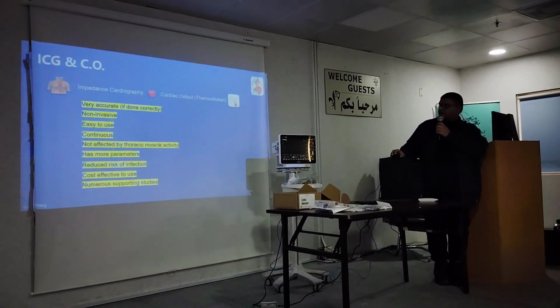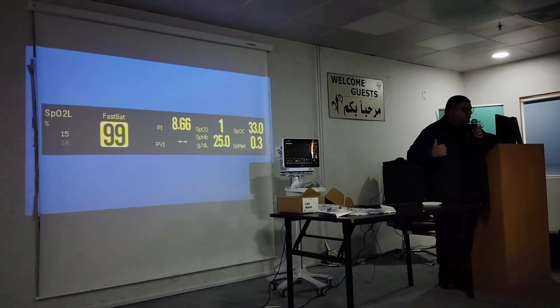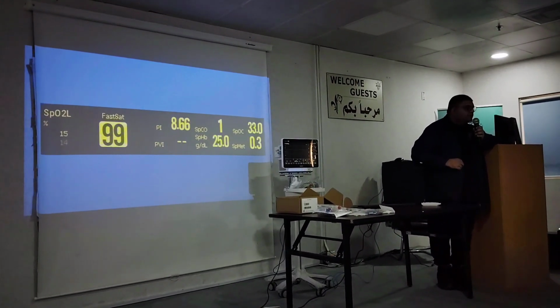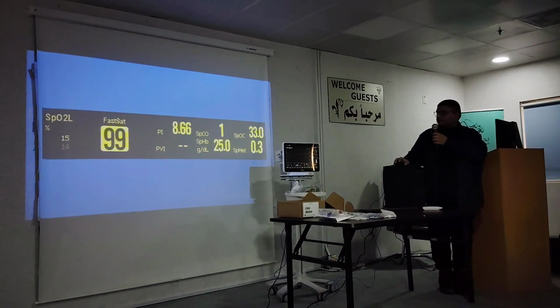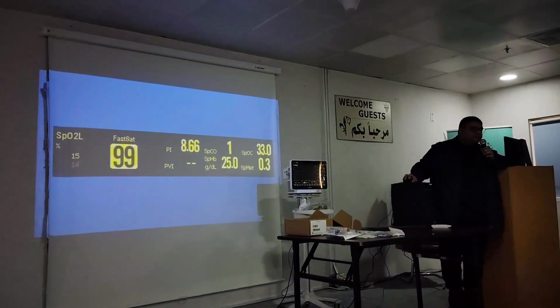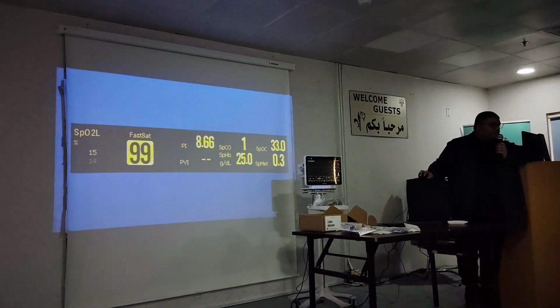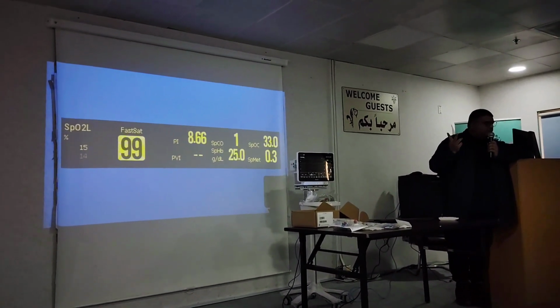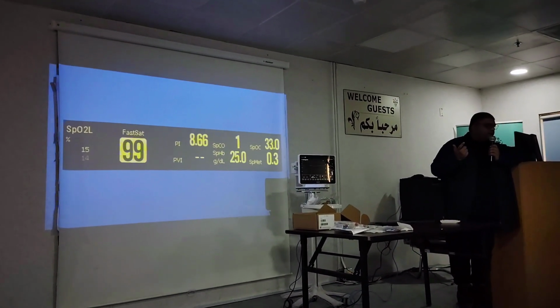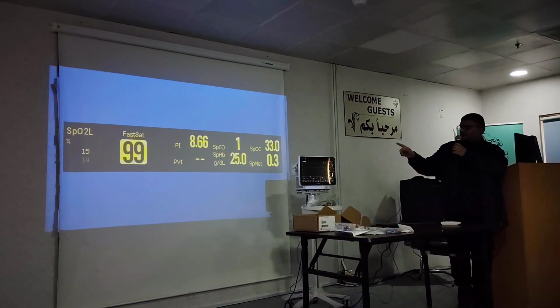Okay. Now, I know all of you use SpO2. Have you guys seen this kind of SpO2? Fast saturation. This is Masimo SpO2 with rainbow parameters. Now, what does that mean? Well, actually, they have 7 parameters. Normally, we have like what, 3. We have SpO2, we have perfusion index, and we have pulse rate. 3 parameters from SpO2, right? But here you have 7.